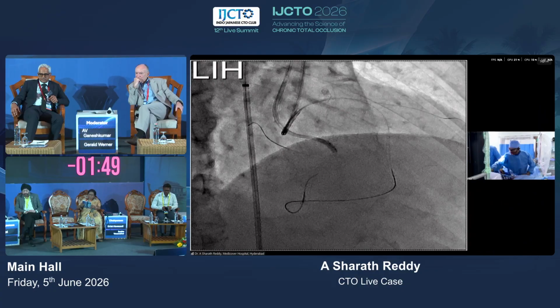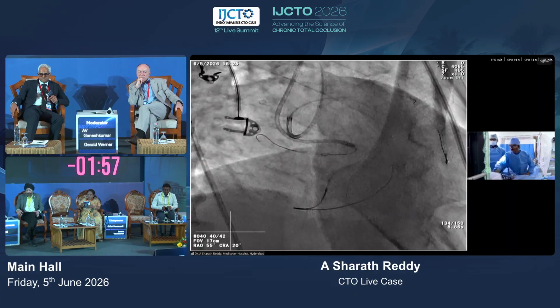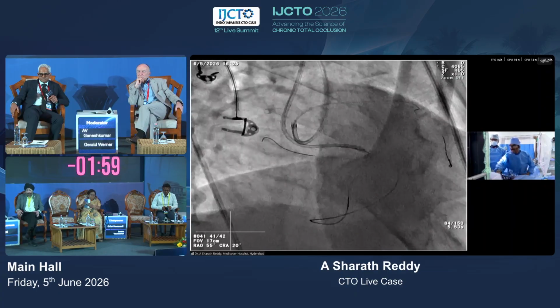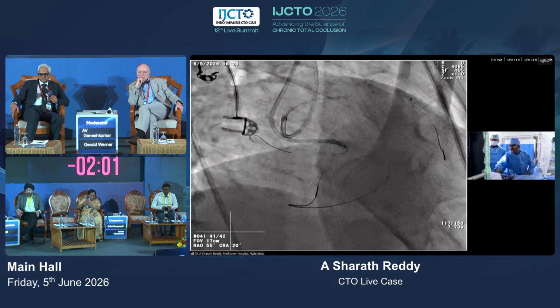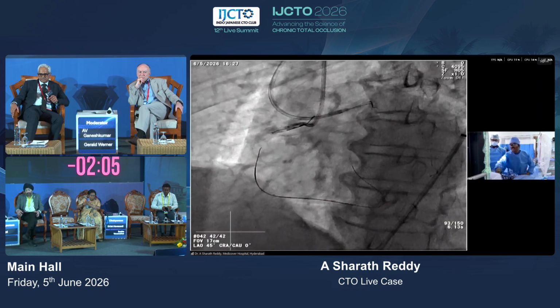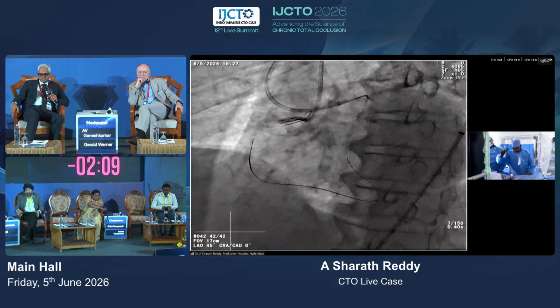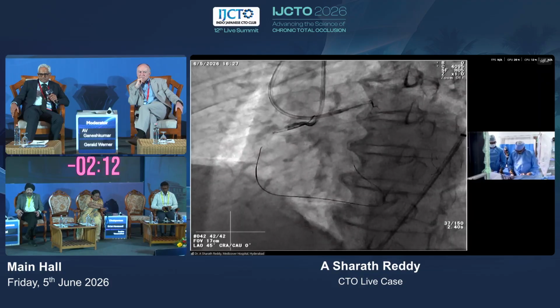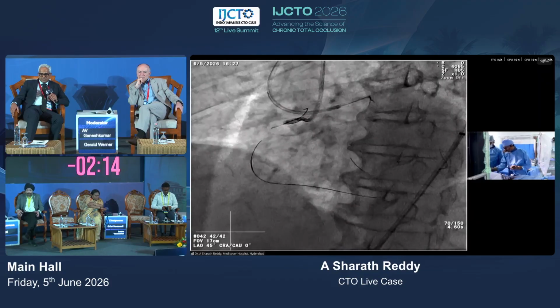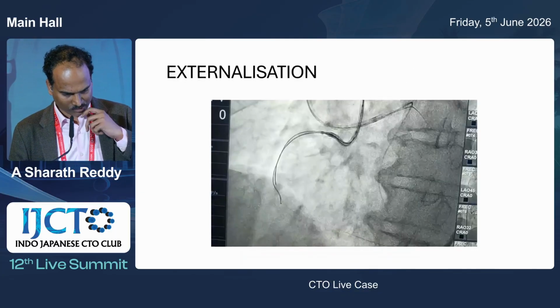I'll just show you, I knuckled antegrade, so I can show a couple of things. You can see this knuckle, but it is going into side branches as predicted. So now, again, I'll just take my chance or luck on a retrograde knuckle. The knuckle is just going into side branches. I'll show the case first.